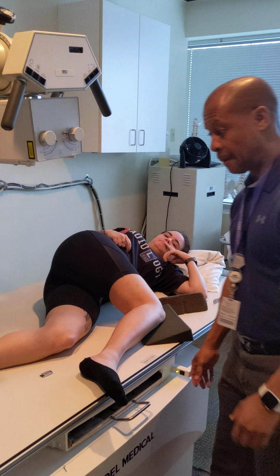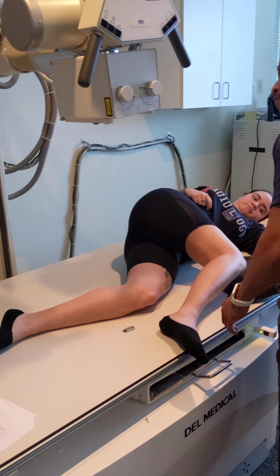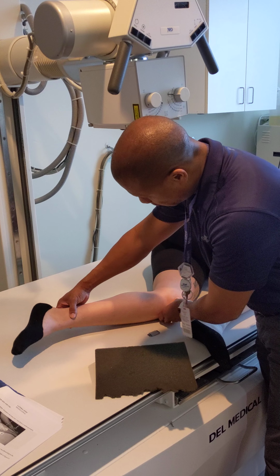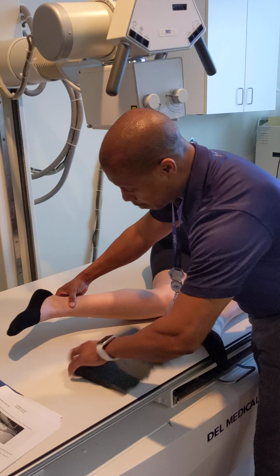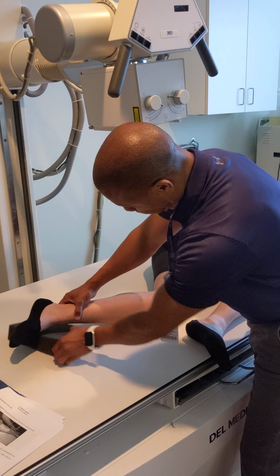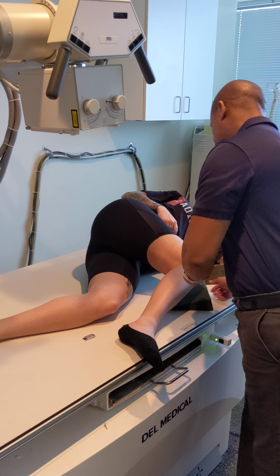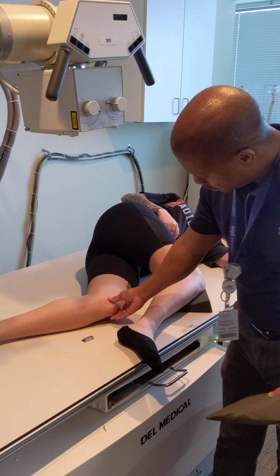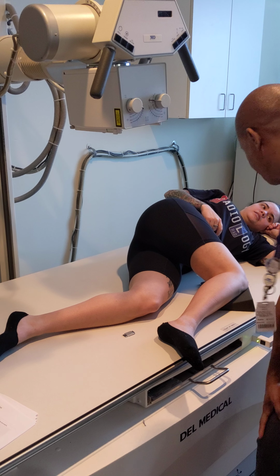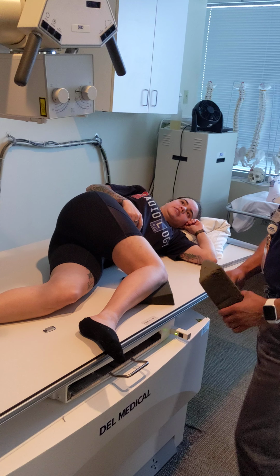And the feet don't have to be dorsiflexed or anything? No. So I'm going to take this with you just for a second. All right, roll down, roll down. Now some patients need a little bit more. Some folks have an issue where they do like this, and you have to prop something underneath their foot. Okay. And that's because by doing that, you'll see it change. Because some folks, how their knees are, is kind of weird. Some people will have their heel resting on the table. That will also affect how the knee is rotated.